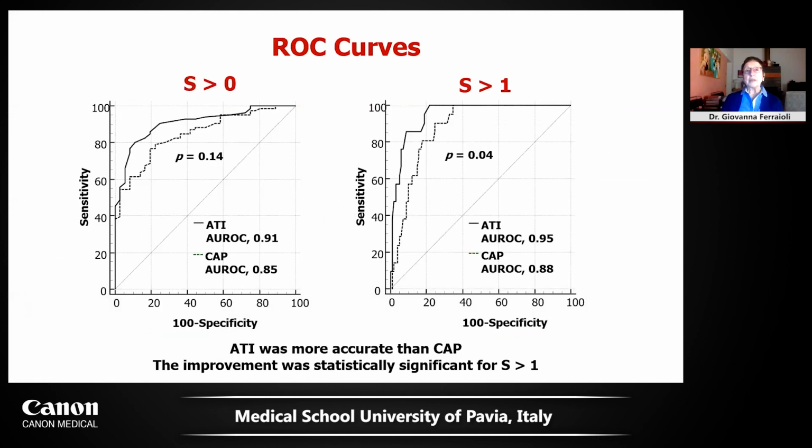And these are the ROC curves for S higher than 0 for detecting steatosis and for detecting significant steatosis. The ATI was more accurate than the CAP, and this accuracy was significant for the assessment of significant steatosis.